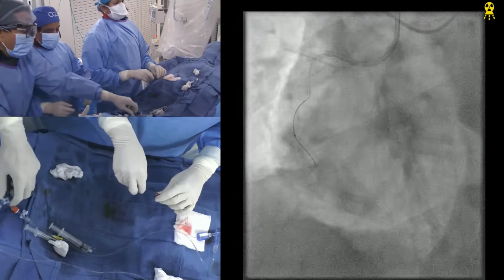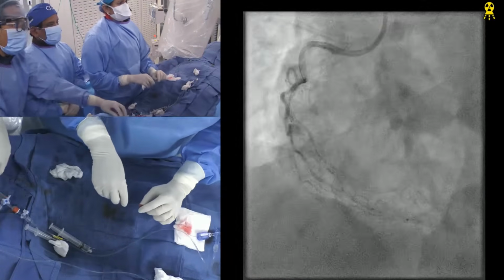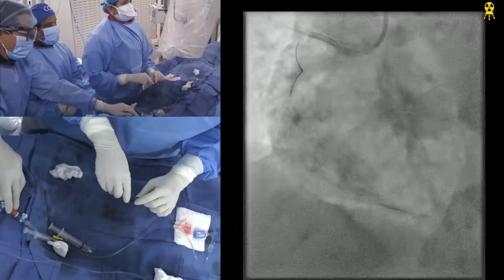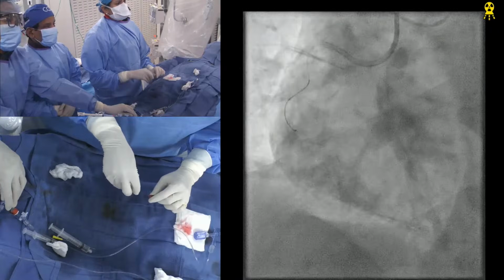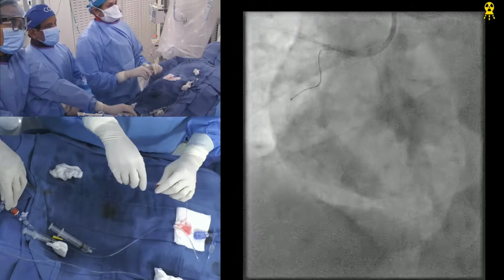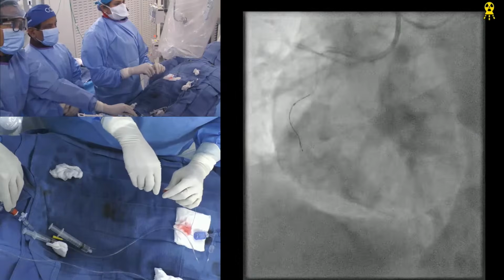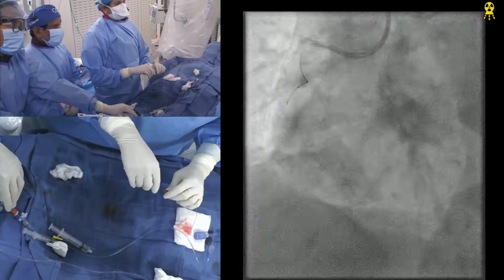Same thing, right? Yeah, exactly the same, I think. Oh, right here, see that? I think it goes subintimal, the same place, but much higher. Yes, much higher than the first one that we did. Here it has to get into the lumen. I think the contributor here is the Corsair, because that was behaving very strangely and kept directing the wires. So whichever wire you use, irrespective.